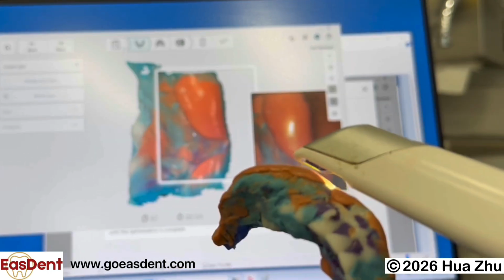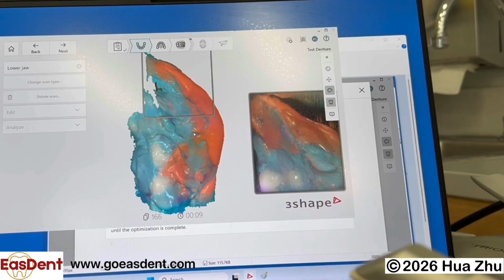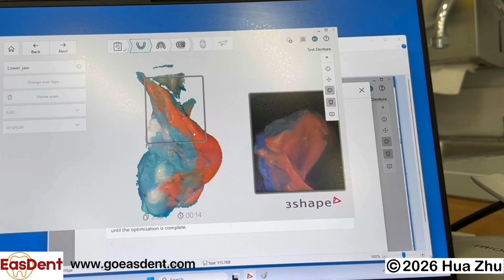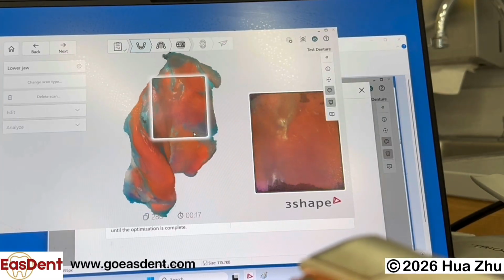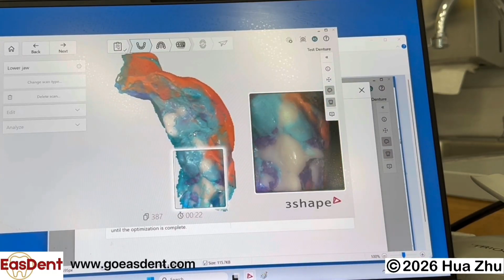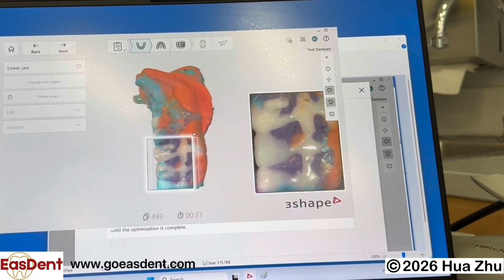It may differ from your scanner's recommendation, but it has worked the best for me, especially with older scanners that do not capture impressions or dentures reliably. This approach reduces the chance of scan images failing to stitch together correctly, particularly along the borders.